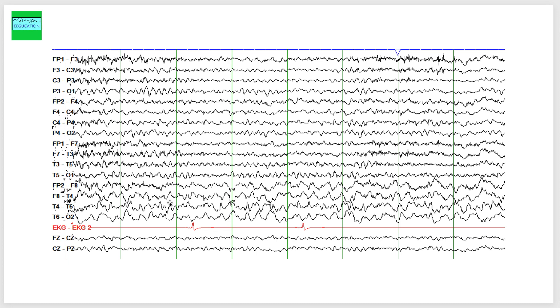Something that we call ictal bradycardia. And if a person gets into an asystole, we call it an ictal asystole. So this is a very remarkable drop in the heart rate here corresponding with the start of an electrographic seizure.